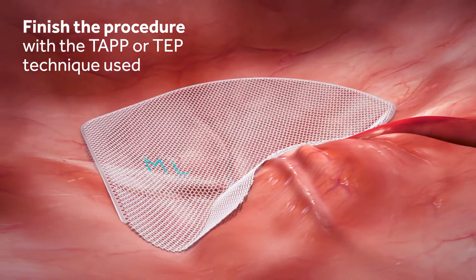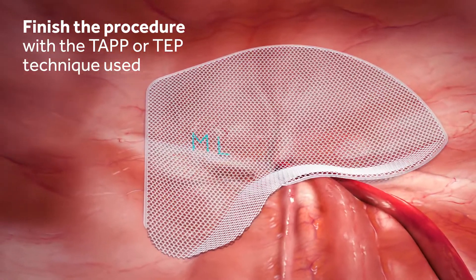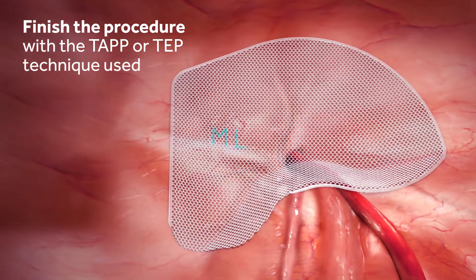Make sure that during space deflation, the lateral and inferior edges stay flat against the abdominal wall and do not roll up as the inguinal space deflates.